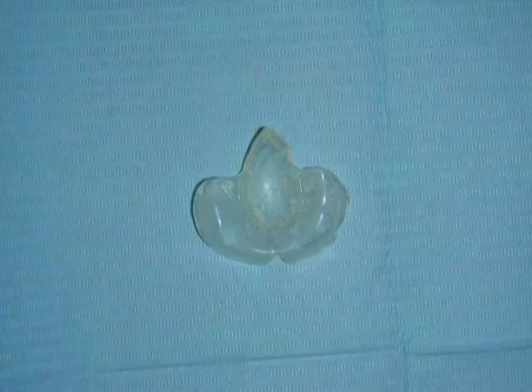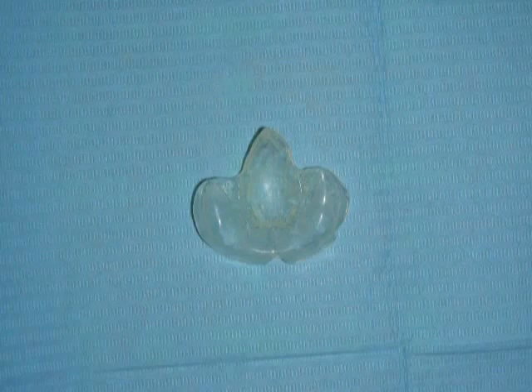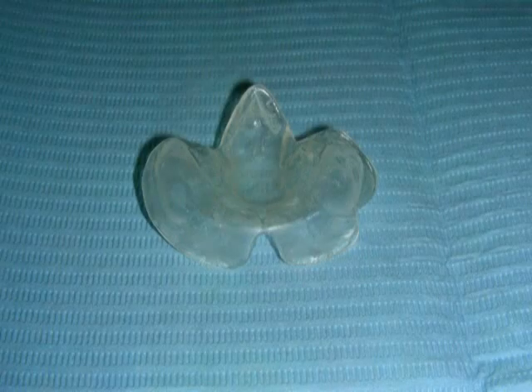This is the feeding obturator. As we can see, it has a posterior extension that extends to cover the soft palate. However, Elias did not tolerate this posterior extension.